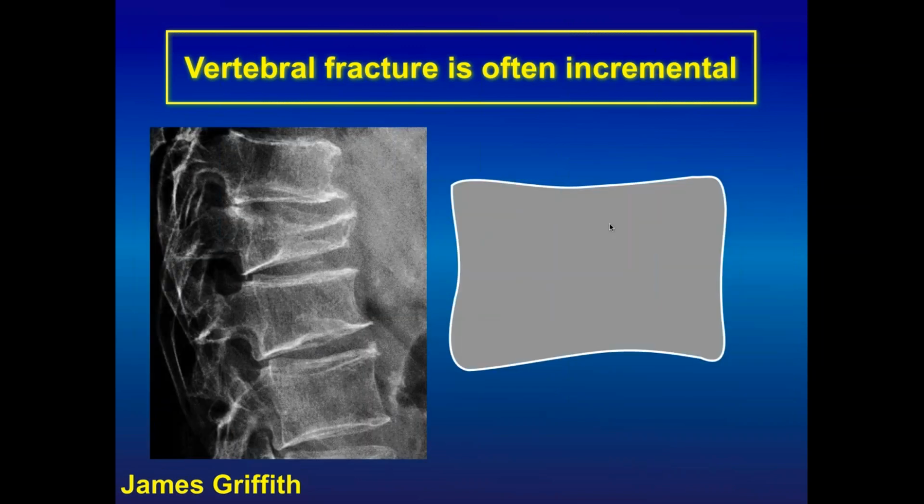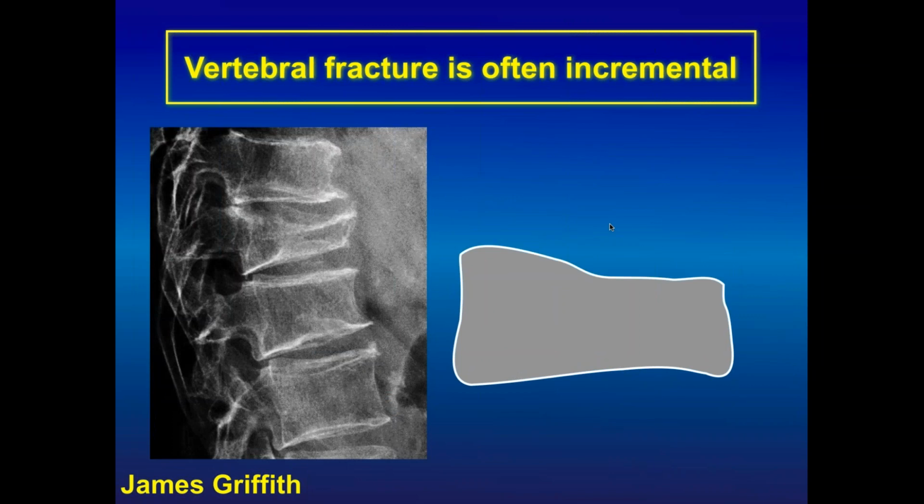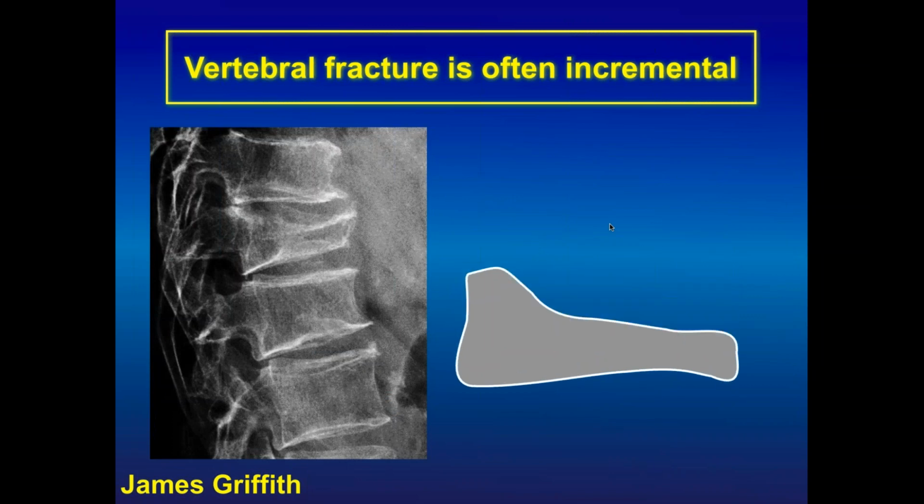But over a longer period of time, it's not at all uncommon to see that there is incremental collapse.